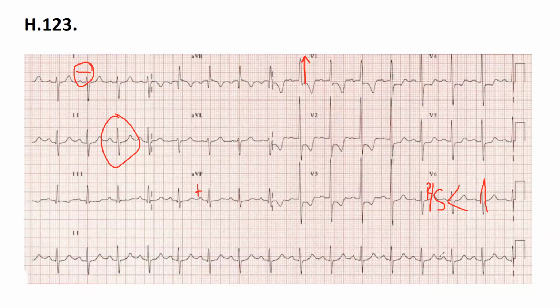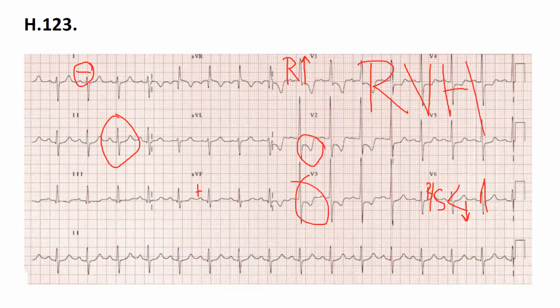Is there an ST elevation of some kind? We're still in the QRS. Maybe in large QRS, like a tall R wave in V1 and the R/S ratio less than 1 in V6, V5 because the S wave is too deep. It means that we do have right ventricular hypertrophy. And again the strain, what you do see here, the strain phenomenon.